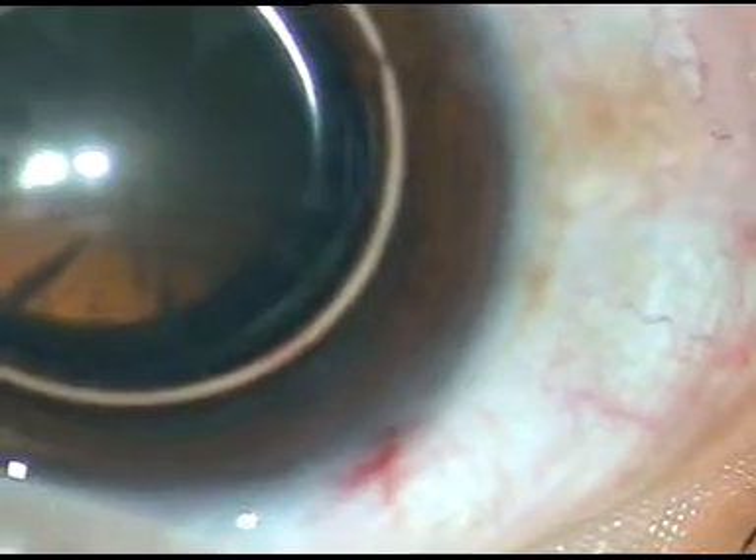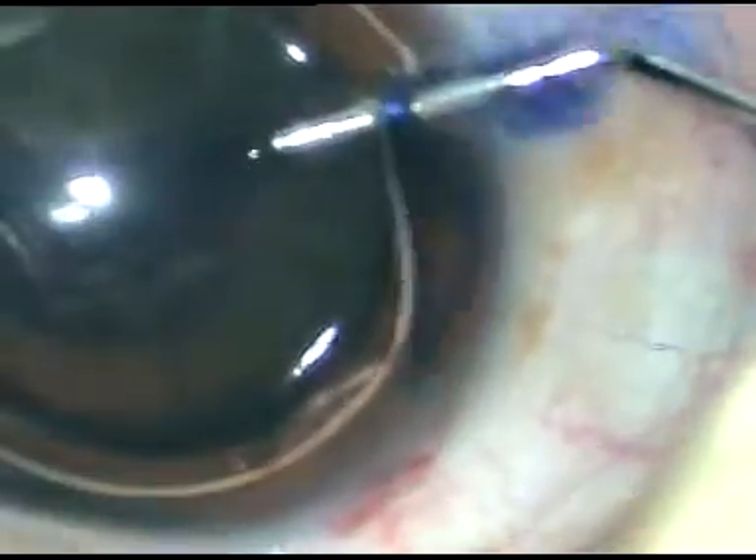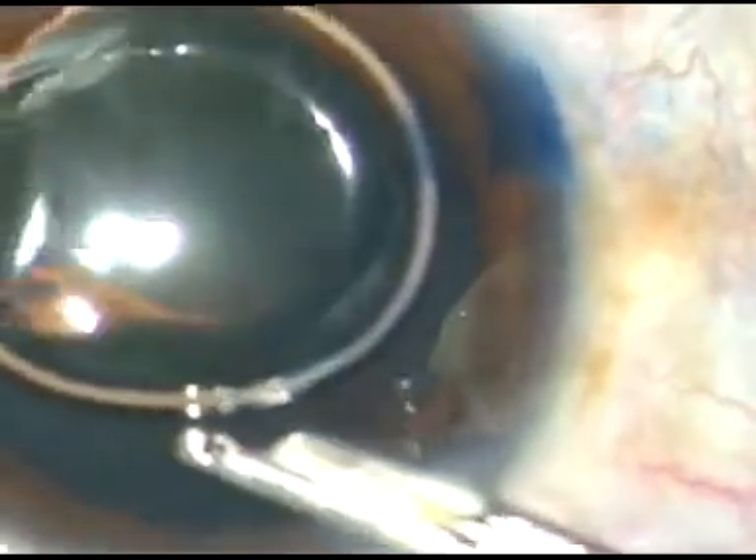I have taken up this case for surgery. By this time, two incisions have been made. Now I am staining the anterior capsule with trypan blue dye to demonstrate capsulorhexis. The dye is washed out. I am going to use HPMC, that is hydroxypropyl methyl cellulose, in this case as the viscoelastic substance.